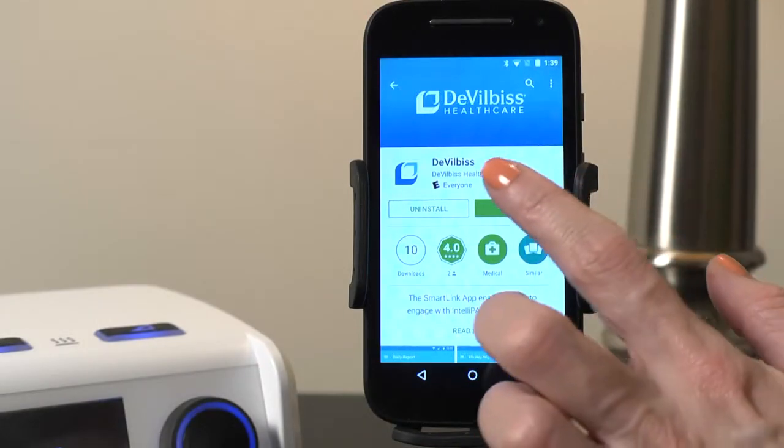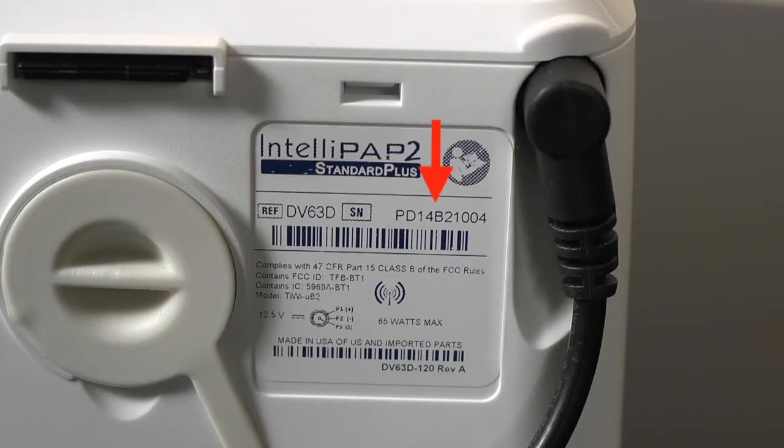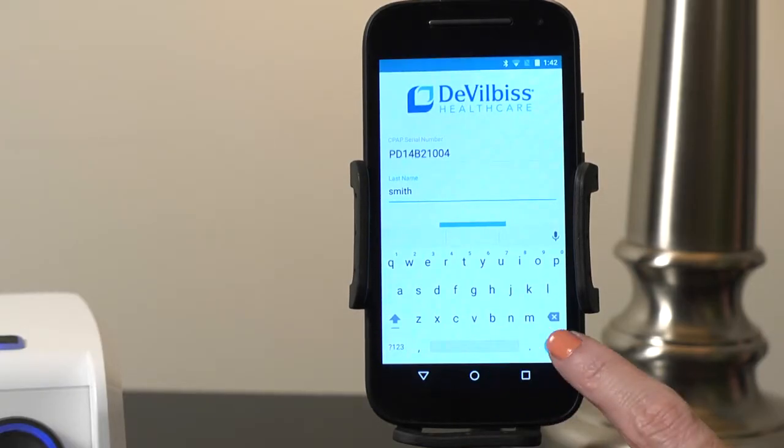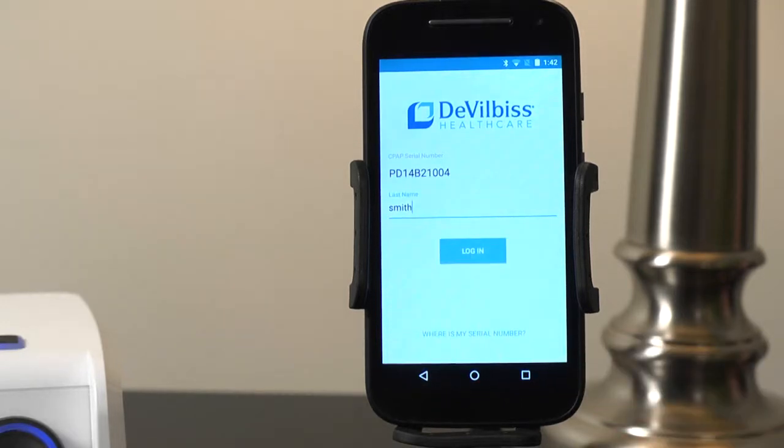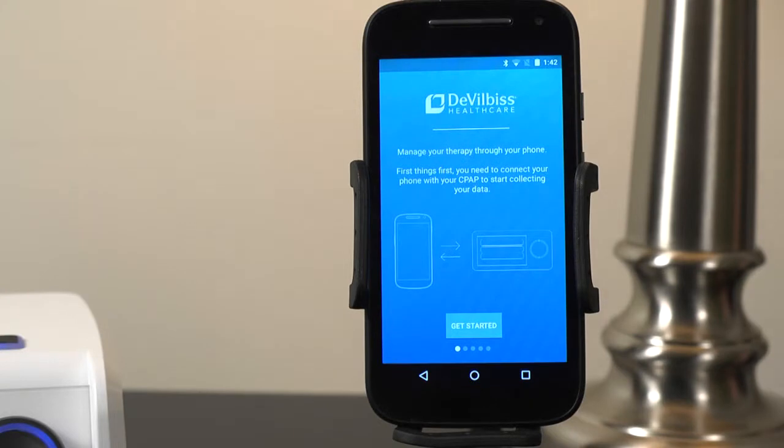Once installed, open the app and log in using your IntelliPAP serial number found on the back of your device and your last name. Be sure to use capital letters in your login. Press the button to accept, then tap Login and basic connection instructions will appear.